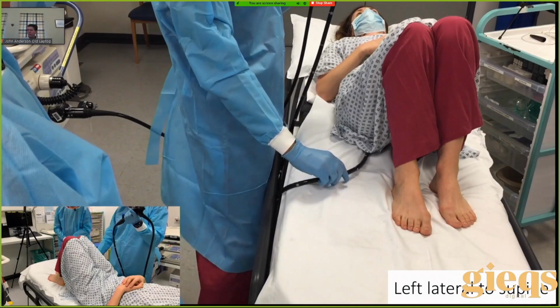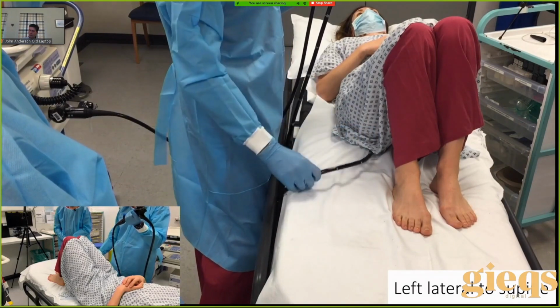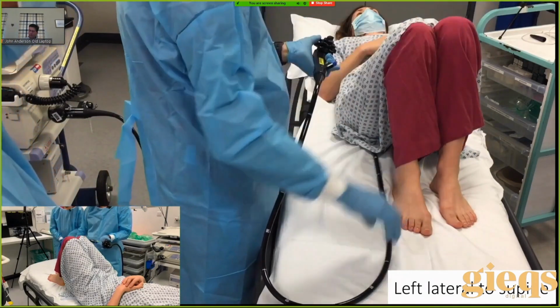Here, there are two problems. One is the scope's coming out at a slight angle, and the second problem is it's falling off the bed. So to stop that happening, we move the scope back to where we were. We're watching the screen all the time.